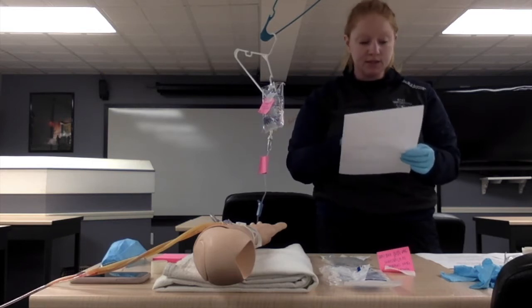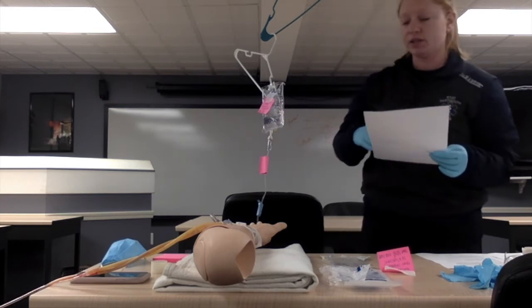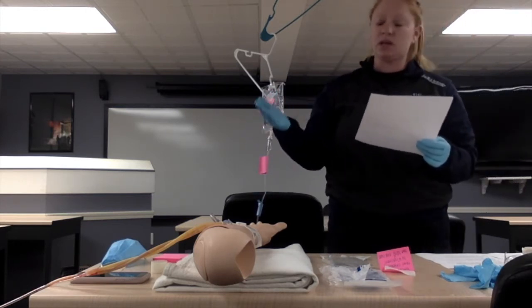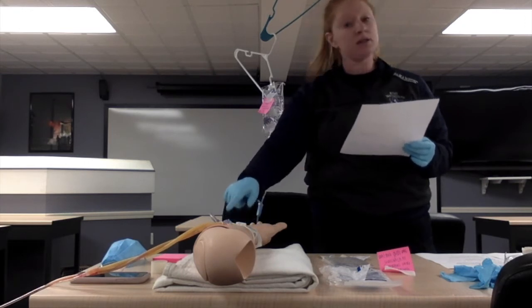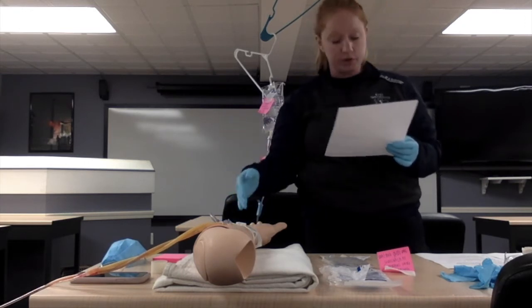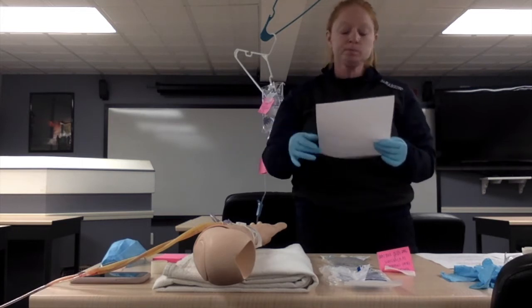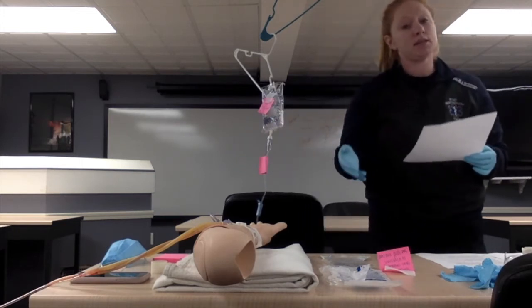Now this is for Ellen Davis, date of birth 9/1963, no known allergies. Going to confirm with the patient. Ms. Davis, make sure she identifies with at least 2 identifications, so name, date of birth. Going to look at her patient band just to make sure that it is the right patient, right date of birth, confirm no allergies, mark that against the provider orders and what the patient's saying, so I know that I have the right patient. Then I'm going to continue on with the 6 rights.